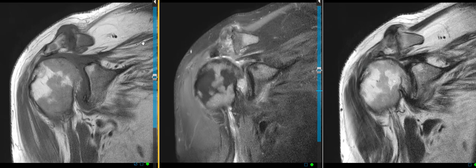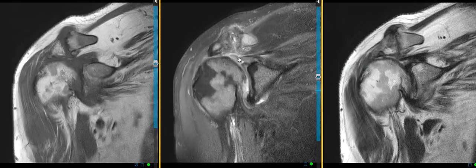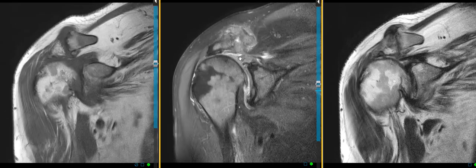This is the supraspinatus muscle. It's infiltrated with bright fat — fatty atrophy of the muscle — meaning that the tear is long-standing. The tendon ends about right here. It should end over here, so it's torn and retracted way back to here. Here's the torn end of the supraspinatus.